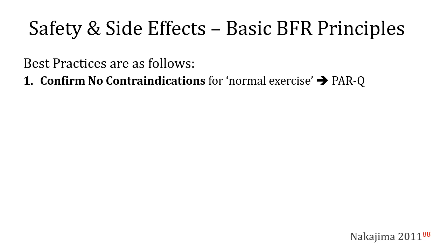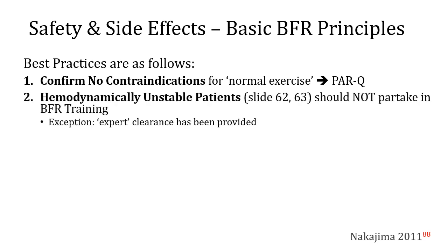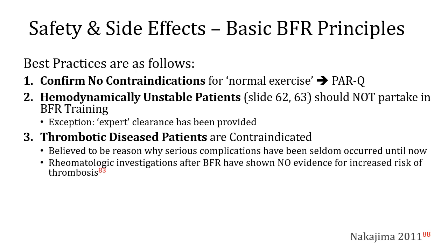Additionally, video number 2 gives an extensive overview of an algorithm and screening process that can be utilized in order to risk stratify someone's potential for having an adverse response to blood flow restriction training. Second, hemodynamically unstable patients, as shown in part 2 of 3, should not partake in BFR, with the exception that there may be expert clearance provided even in the hemodynamically unstable patient.